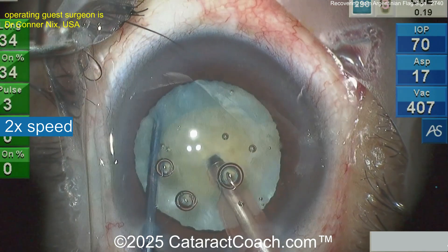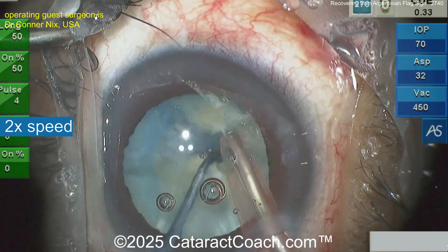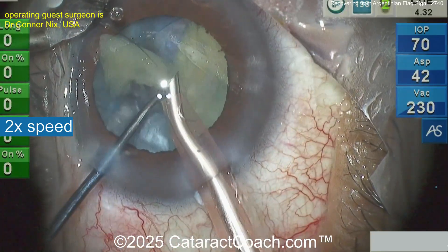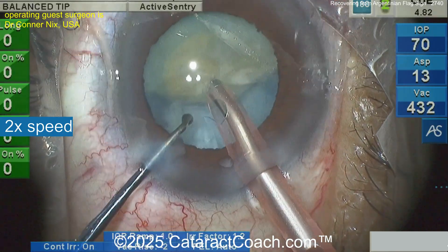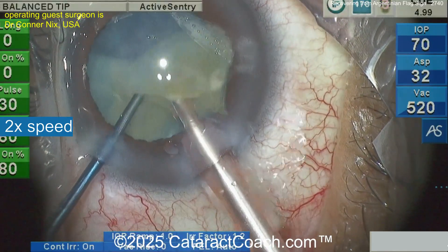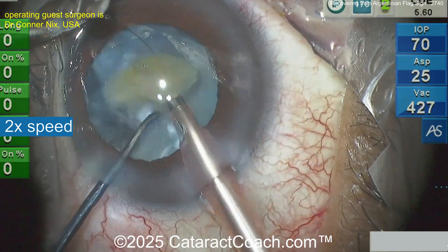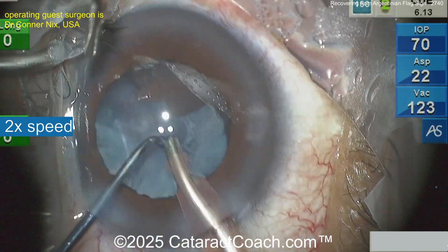Now here coming in with a nice chop technique — horizontal chopper in this case. Buzz in with the phaco probe, and the chopper goes — beautiful. Clearly an experienced surgeon doing a great job taking these pieces out. For the lens placement, you can still make it in the capsule bag — I don't think you need a sulcus lens on these. There's a nice chop technique, beautifully done. Taking these pieces down, nice and easy. These patients are very thankful and very happy. Always remember — it's the delta, the before versus after difference, which is what patients really notice.